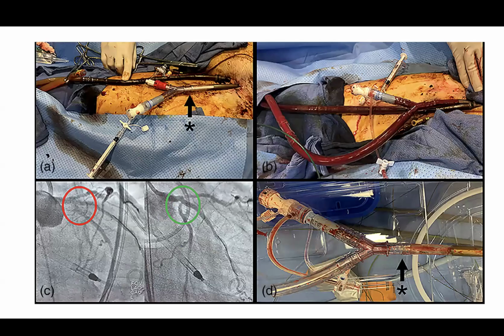Here, this was another one. This is a nice one too. This was a case on ECMO and venting who had STEMI, and we had no access, no radial, nothing. So what they did is they spliced a white connector, see this white connector here, into the arterial return cannula, and then had a dry seal and pretty much created a, what do you think this is?